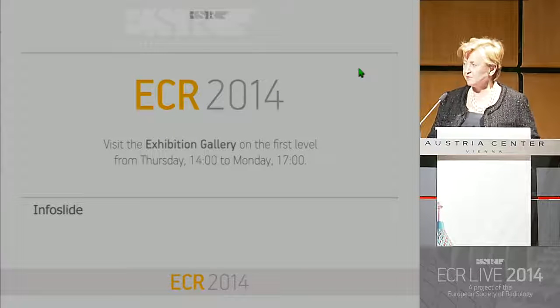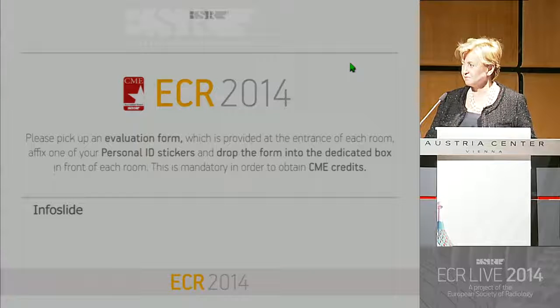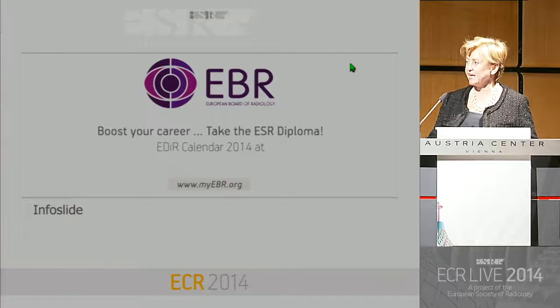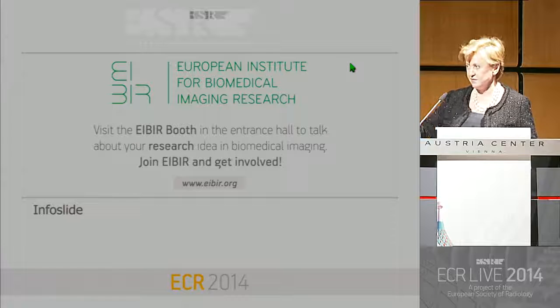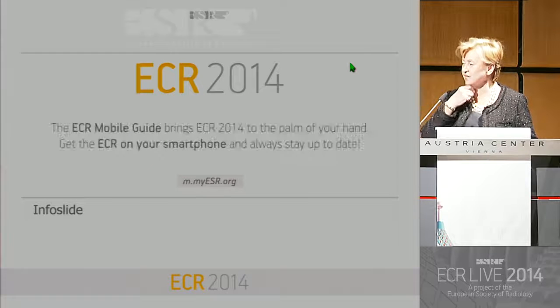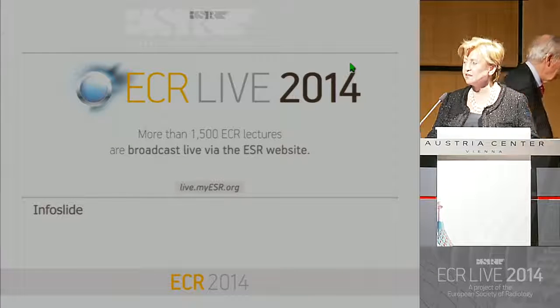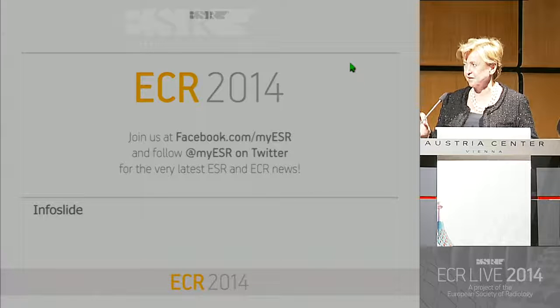I do believe that for the routine clinical studies, you actually don't need contrast. I know that we can all show anecdotal cases where contrast really helped, but there are so few between. And when you look at the time it takes, the UK study on cost effectiveness, really looking at the cost and how much the difference there is when you use contrast, I just don't think you can justify the use of contrast for the routine studies.